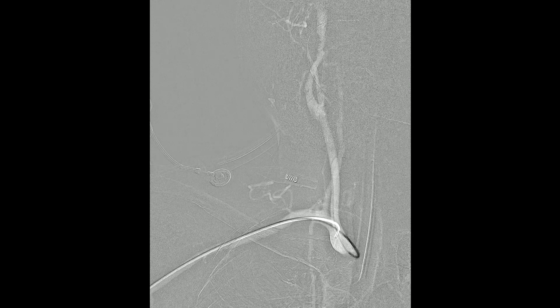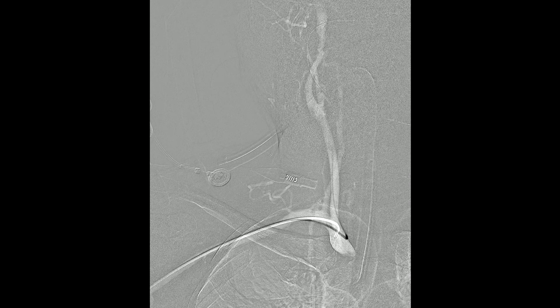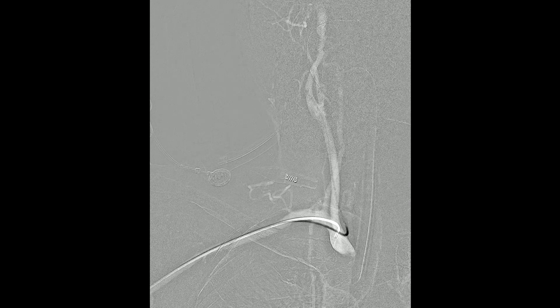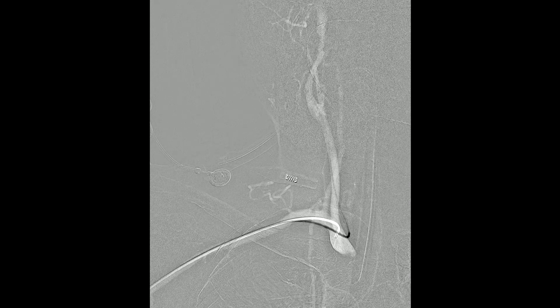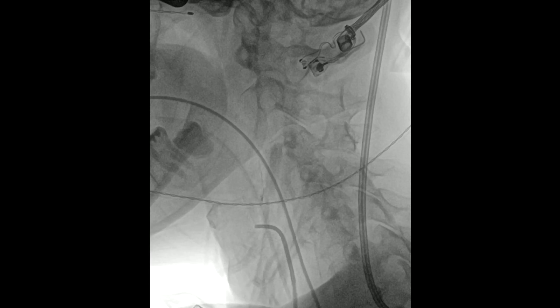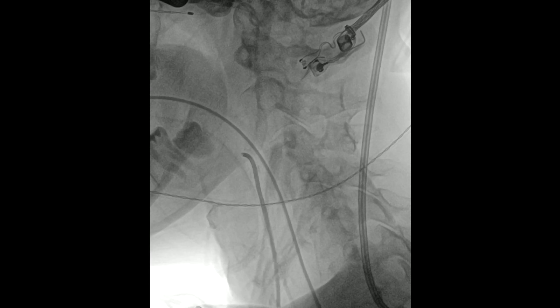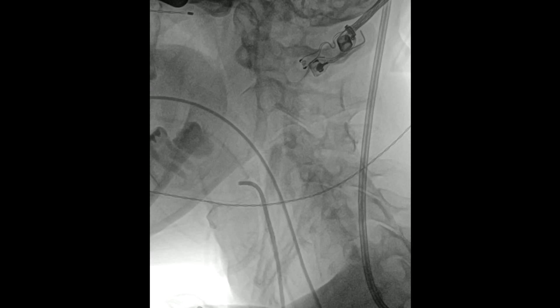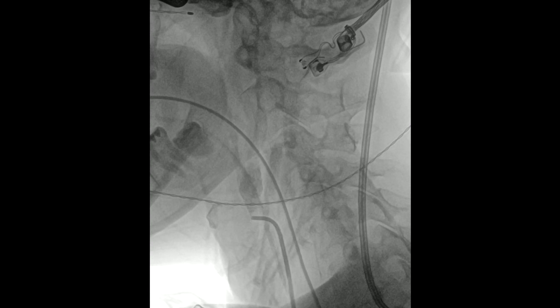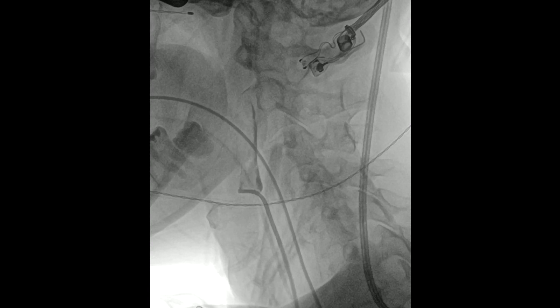You can see it's backing out just a little bit — get a little more wire, shorten up the catheter a little bit, and the catheter will actually go up into the common carotid artery. The catheter goes up in the common carotid artery, and here's the lateral view. We're going to shoot AP and lateral views of the carotid.